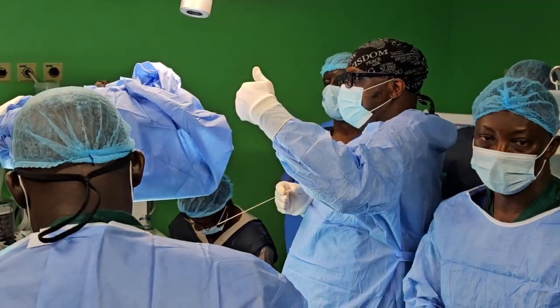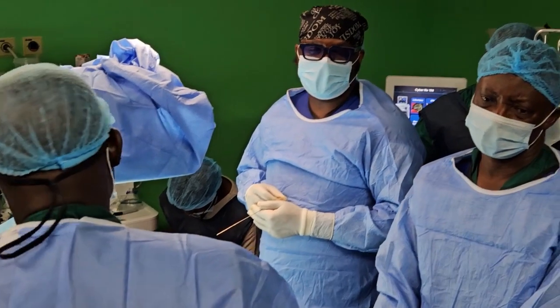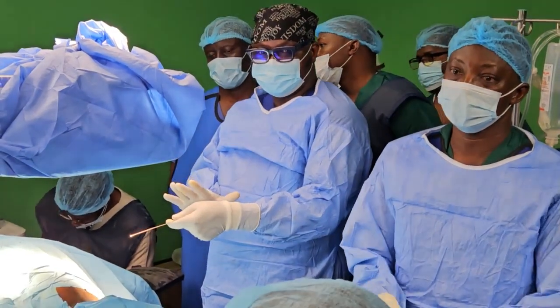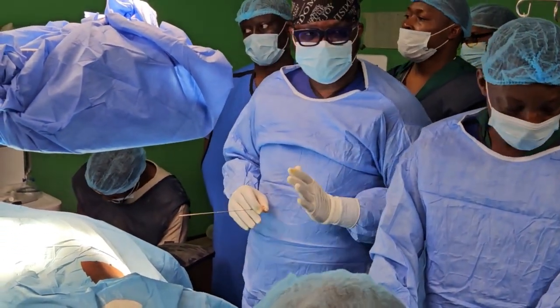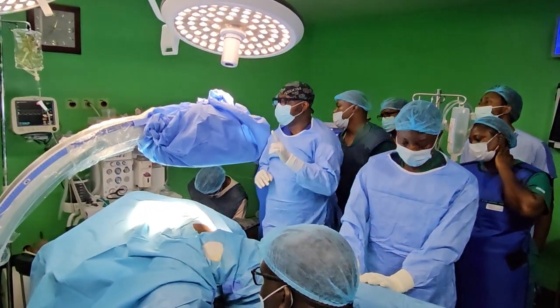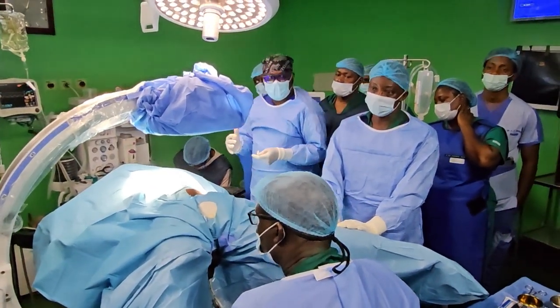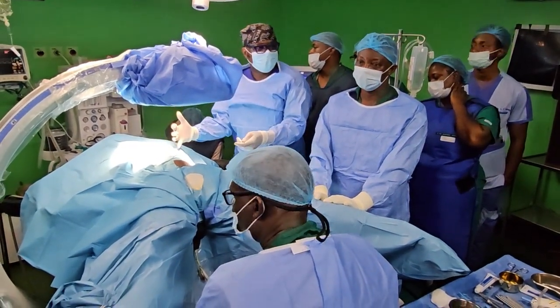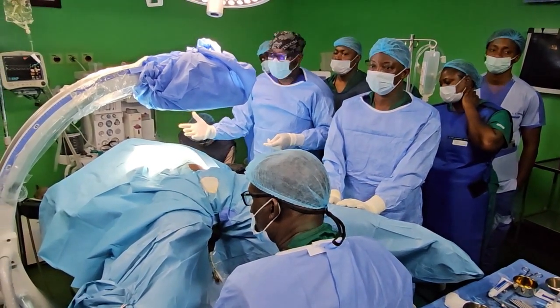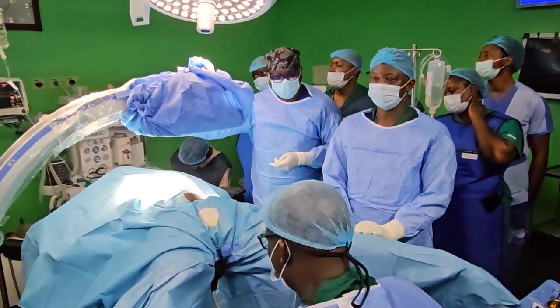From the other side, it's like on the fluoroscopy image screen. I didn't get that. Dr. Lawal, is it possible? From the side, you need the clearance. The build at this stage is very critical, and we are going to give continuous flow. As Dr. Lawal is opacifying the system, I want to see how the stone fits into the pelvicalyceal system. It's very key, because if you opacify the system, it becomes blurry. So I want to see how the pelvicalyceal system comes around the stone. So it has to be continuous fluoro here.